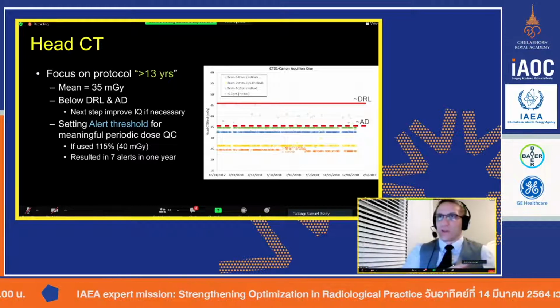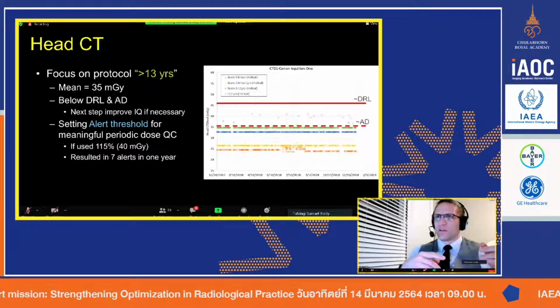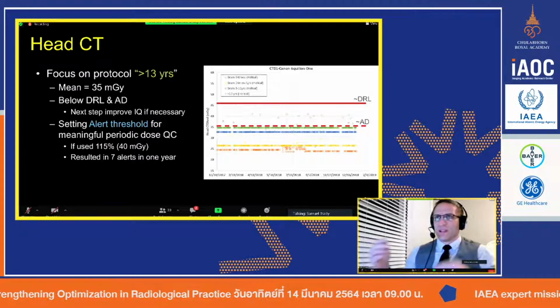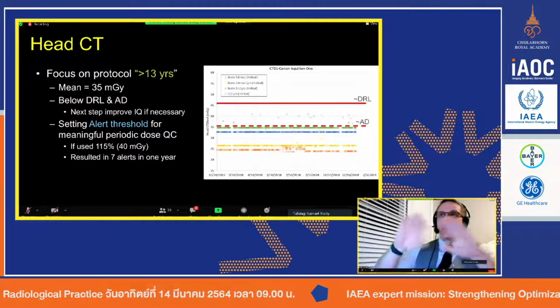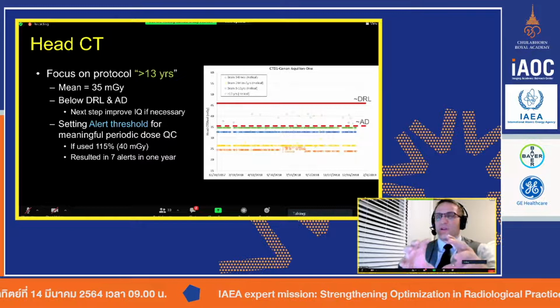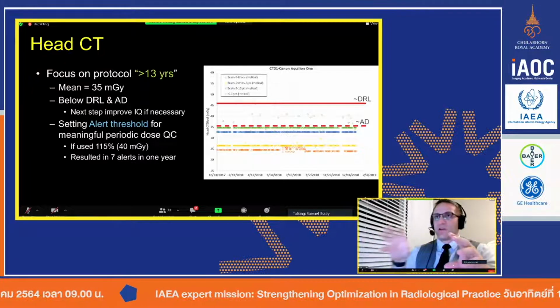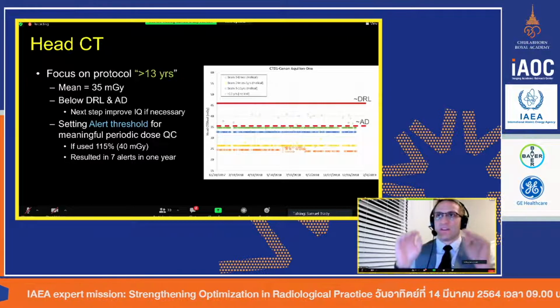This is a retrospective approach, and it's a matter of going, okay, what went wrong? Let's try to fix it. But like I said, if there's ever something that's really high, then the system lets me know. And then even beyond that, the CT scanner itself and our wonderful technologists will have the opportunity to make an intervention or a change if something happens in the moment.